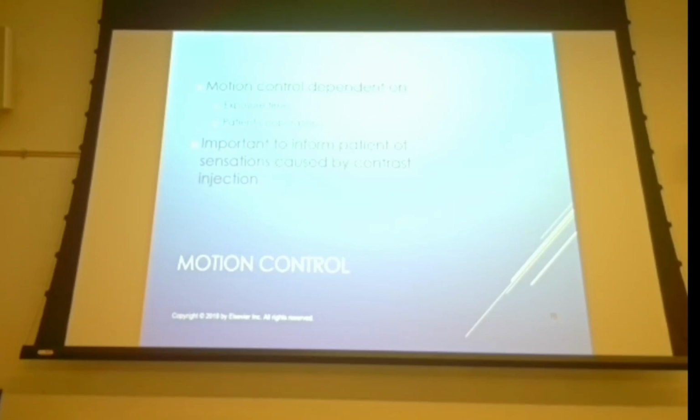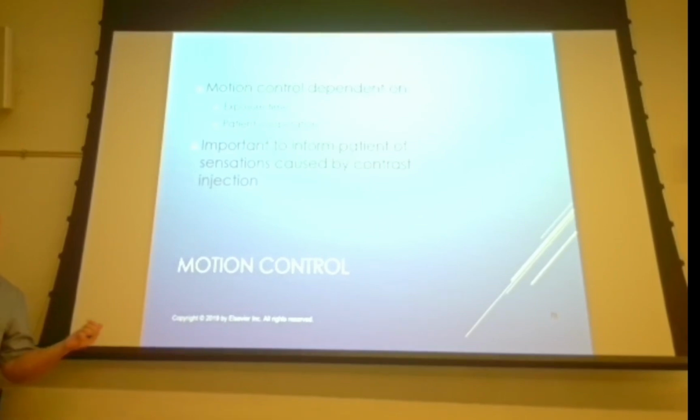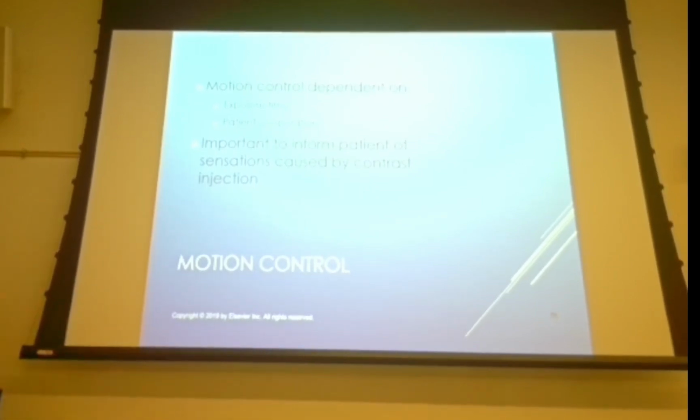Okay, you want to call that involuntary motion, that's fine. Also, sometimes if a patient is in a lot of pain, I've seen this happen as well, the ER doc may give them some pain medication. And if they are even slightly prone to hypochondria, you give them medicine and they're already in pain and they can go off the charts. So some of the worst exams, IVPs I've ever had were patients who they medicated because they were in pain. The medication made them paranoid, and then we injected the contrast.